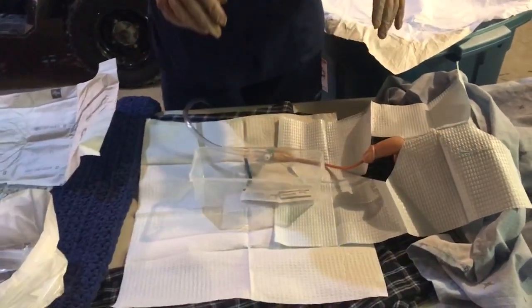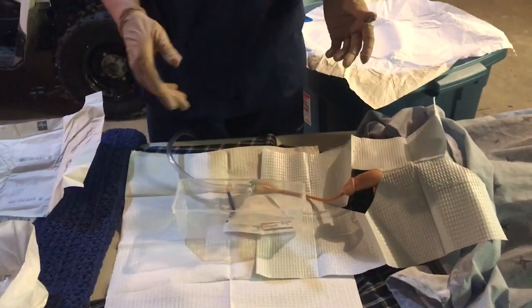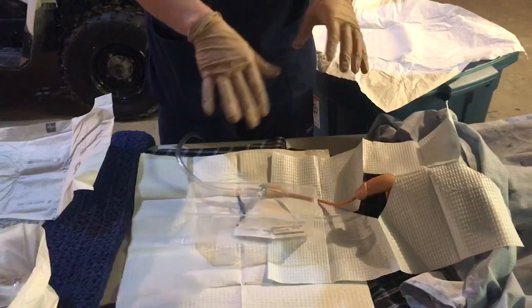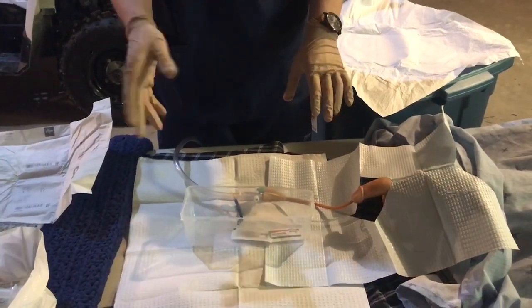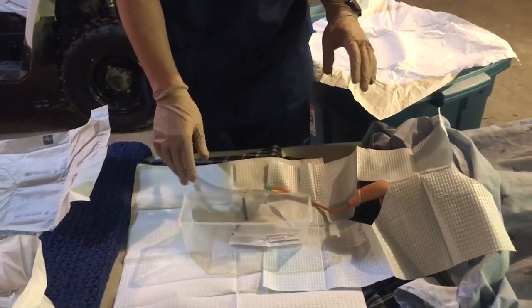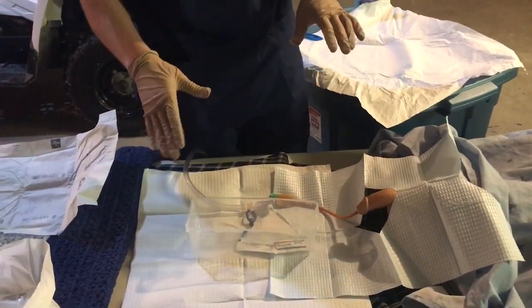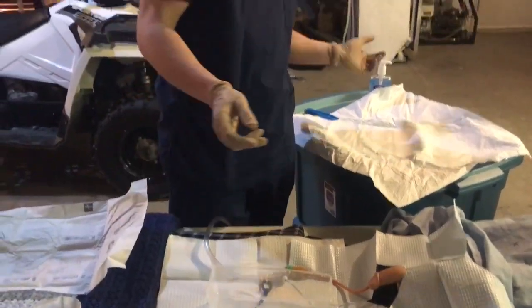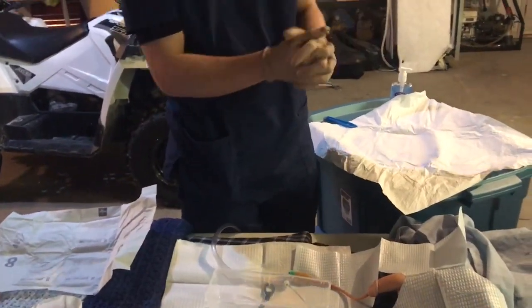Once that's done, I'm going to perform peri-care, clean up any excess lubricant or cleaning solution. I'm also going to clean up the supplies we used here, throw them in the garbage. I'm going to attach this tubing to his leg with a stat lock or a tape, and then I will remove my gloves, throw them in the garbage, and do hand sanitizer.